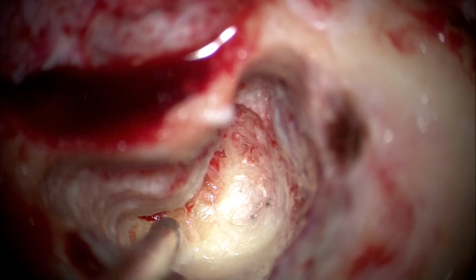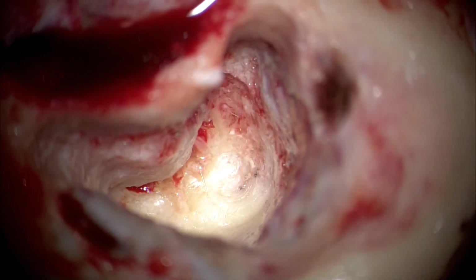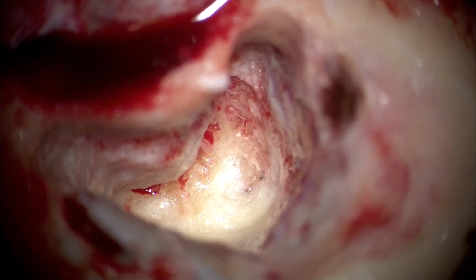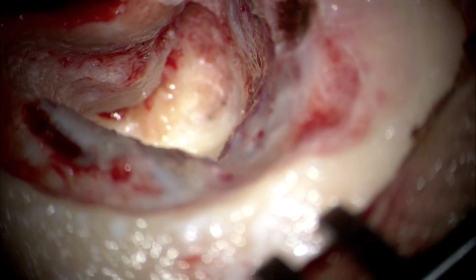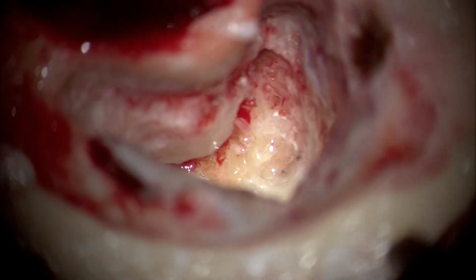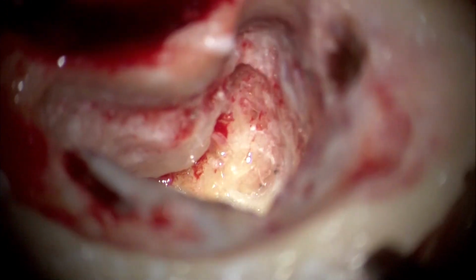Again, the caution being that this sharp instrument, whether it is a right-angle pick or a sickle knife, must not be used against the lateral lip of the vestibule, because then there could be a slight contact or trauma to the facial nerve fibers. So we would strictly use it on the medial bone of the vestibule to scrape it nicely and gently, but not on the undersurface of the lateral lip of the vestibule, because that is the intimate relationship of the facial nerve.